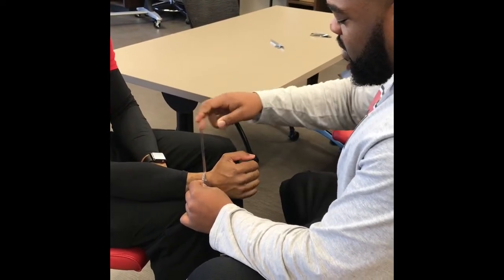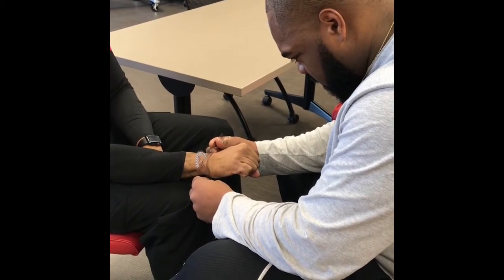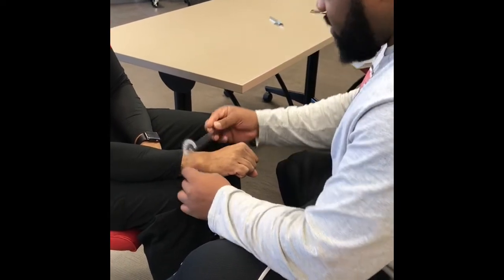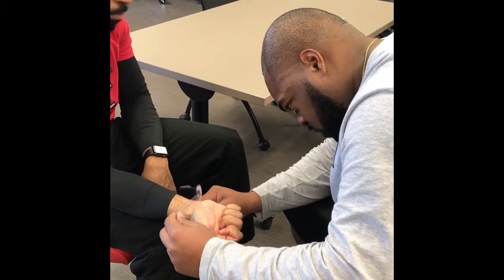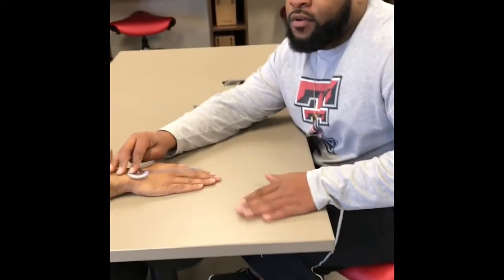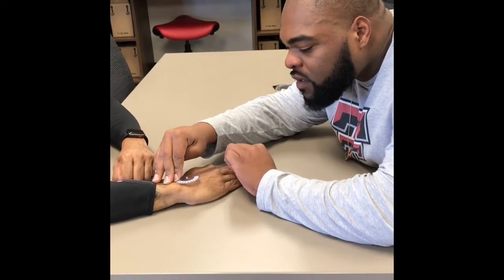So if you would please sir, bring your wrist in like that. The normal range for this one is going to be 0 to 30, so bring your wrist in like that. This one is going to be 31.